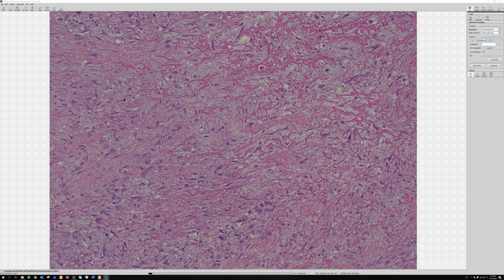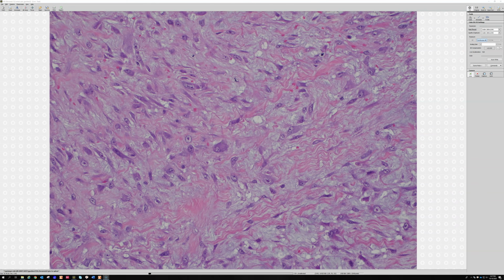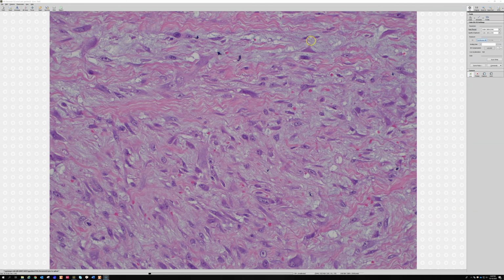But let me point out, what does this look like? Spindle cells, but with big nucleoli, and they look just like those ganglion-like cells in the last case. And look at the background cells, myofibroblasts with purple cytoplasm and spindle to stellate look. See how that guy's kind of a triangle shape? That's what stellate is, kind of triangle-shaped cells. Even though stellate means star-shaped, they never have a 5-point star. They're always kind of 3-pointed triangles. But that growth pattern, purple cytoplasm, triangle shape, is very characteristic of myofibroblasts.